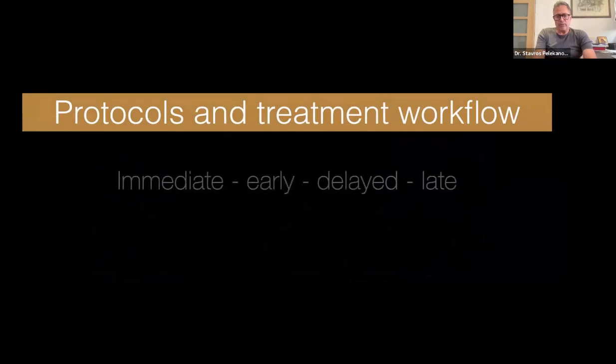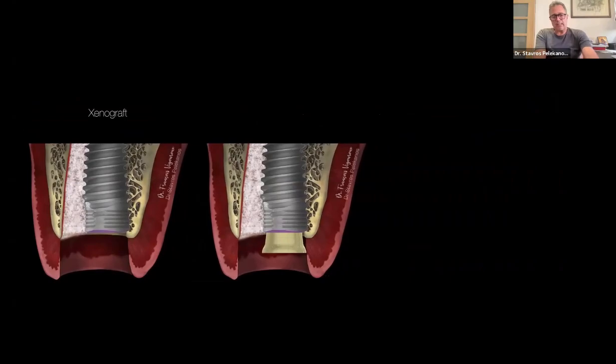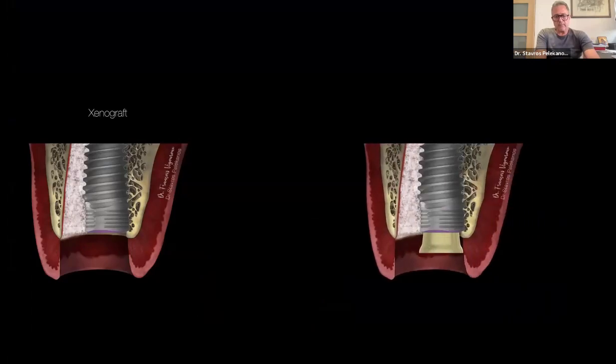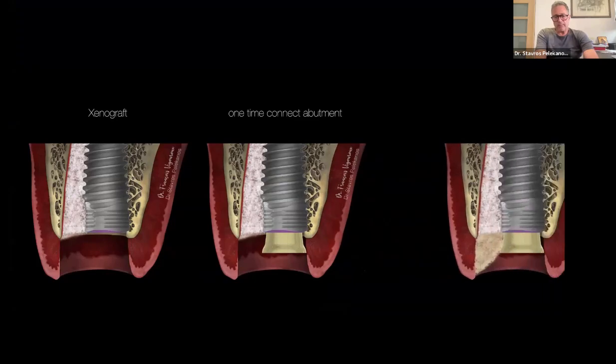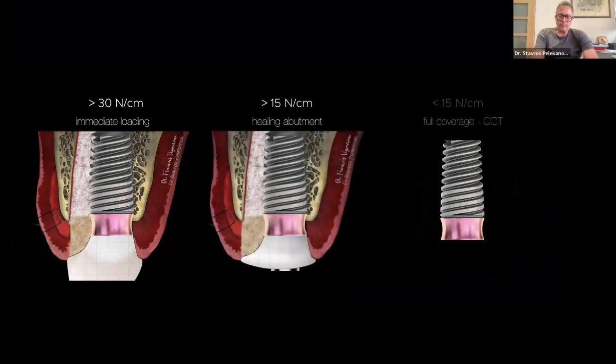So I will show you just 2 cases in the aesthetic zone, and then we will move to our main topic, which is full arch implant cases. These are immediate implants. I'm going to start with immediate implants. And in our case, as I told you, the deep zone is given already by the transmucosal part of the implant, which is already connected to the implant.